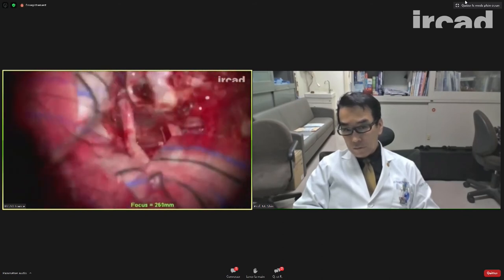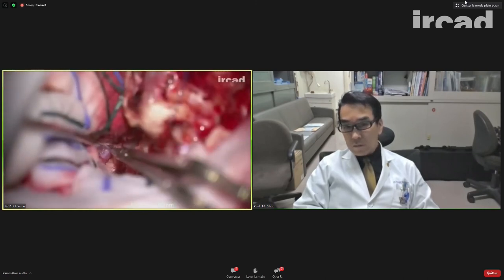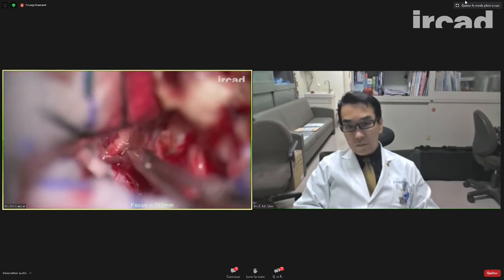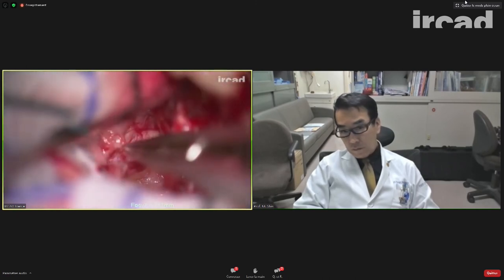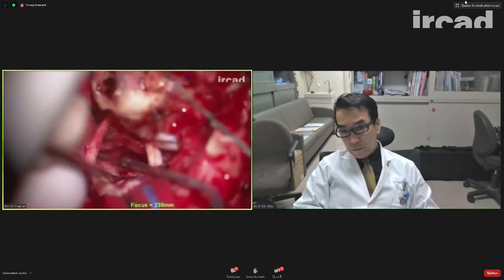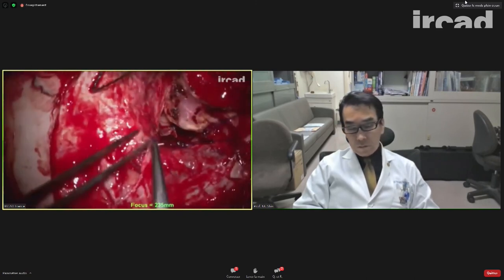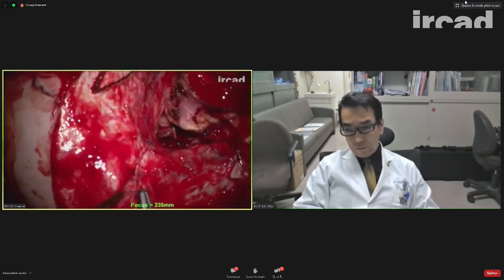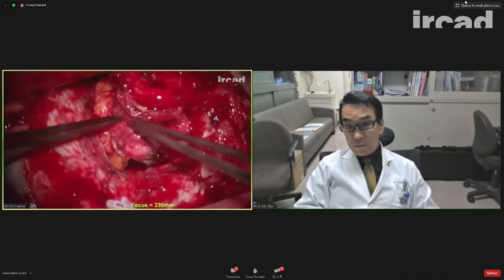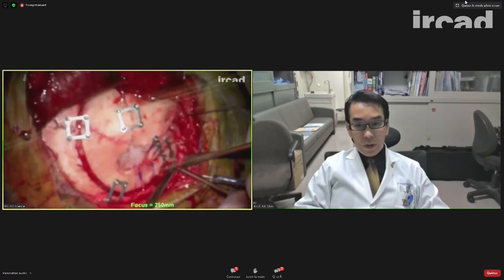brainstem. This is an inferior view of the floor of the third ventricle with the mammillary body. So at the end, this is the dissection of the third nerve, because here you see how the third nerve was completely stretched by the tumor and almost embedded by the tumor. And I think it would have been difficult to control this with the same amount of safety with the endonasal approach. But do you have the same impression about how to predict adherence to the brainstem?